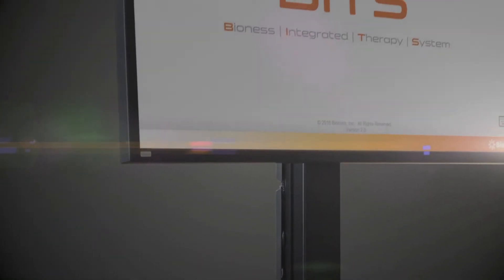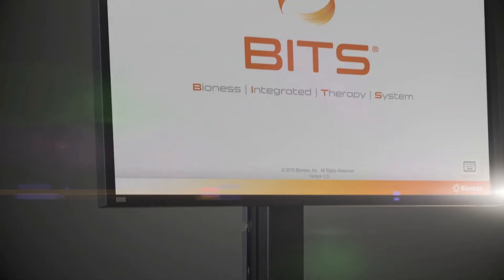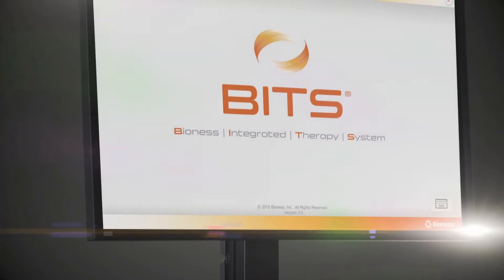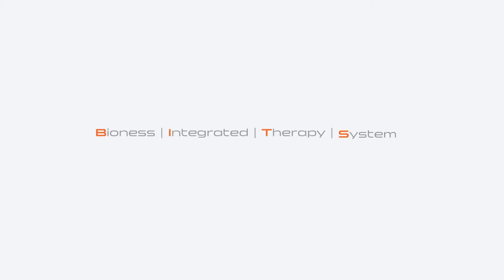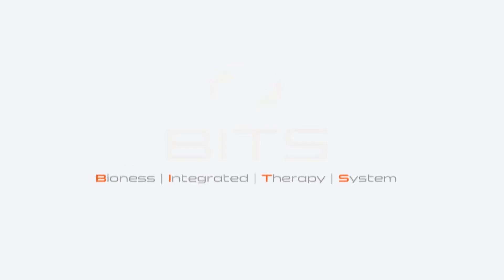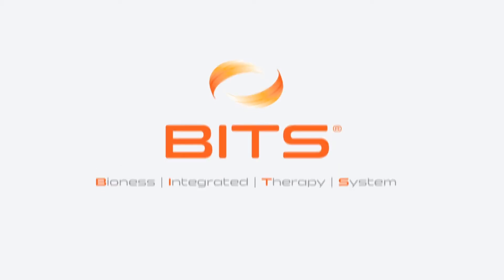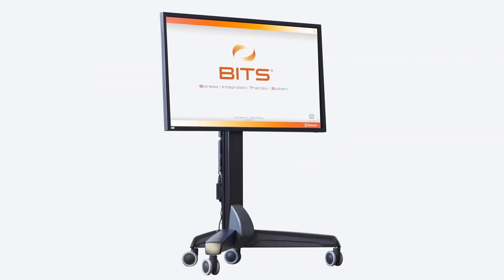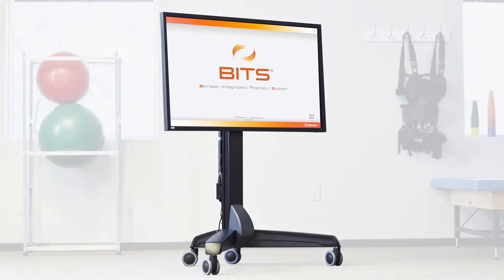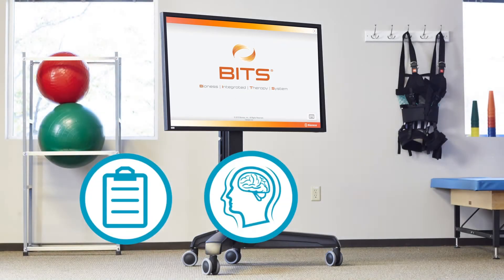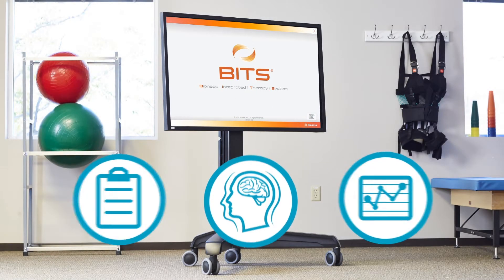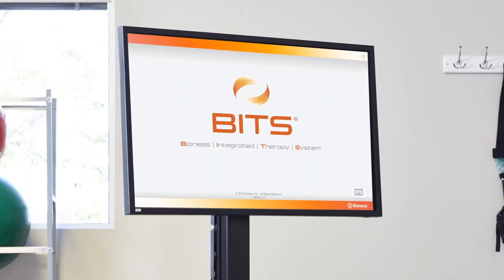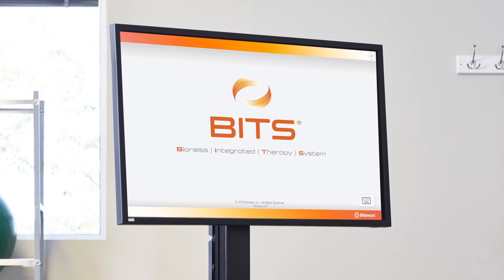Rehab's most advanced software-based therapy solution just got better. Version 2.0 of the Bioness Integrated Therapy System, or BITS, features a range of enhancements that improve your ability to assess, treat, and track progress all in one streamlined and easy-to-use solution.